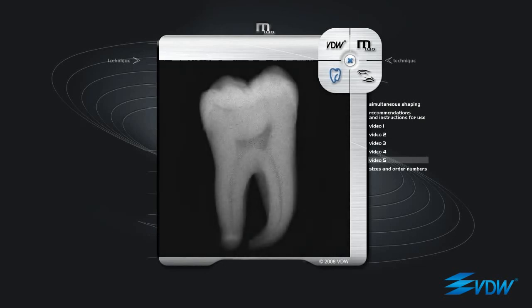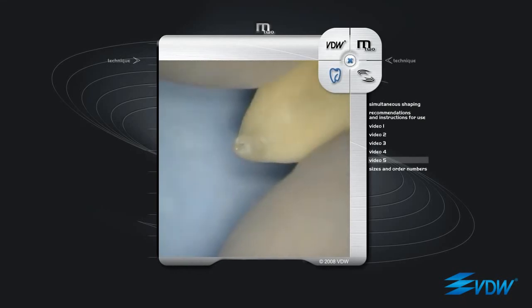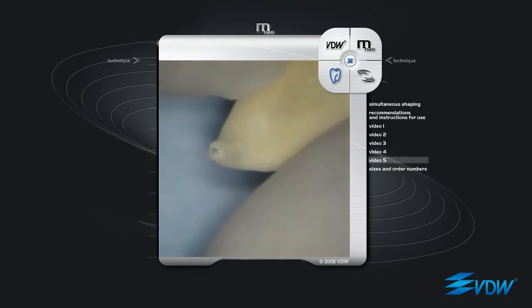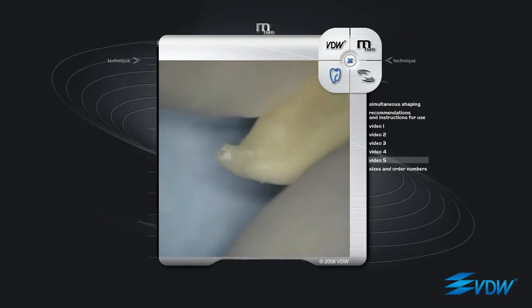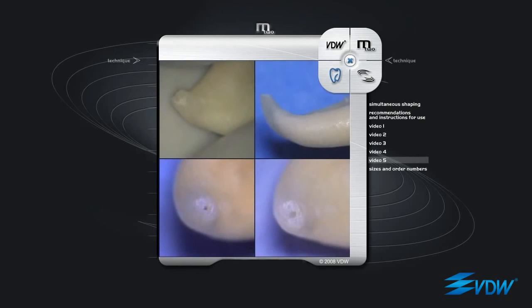A lower molar mesial root canal with a strong curve in the apical third has been selected. The root canal is prepared with M2 instruments using the simultaneous shaping technique. Once it has reached the apex, the last instrument — ISO 25, taper 06 — the largest and least flexible instrument in the basic sequence, is used at full working length for approximately one minute, moving it back and forth, keeping the instrument tip at the apex or just beyond. This has been done to demonstrate the effect of instrument use in respect of apical morphology. The result is significant: absolute respect of the apex and very precise round preparation.